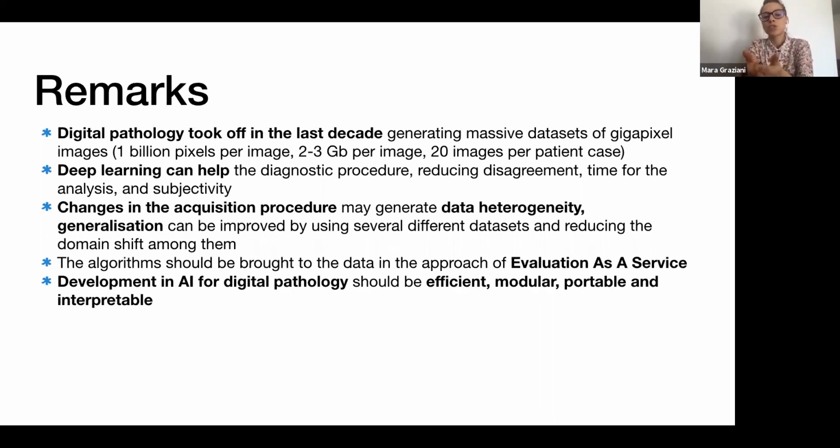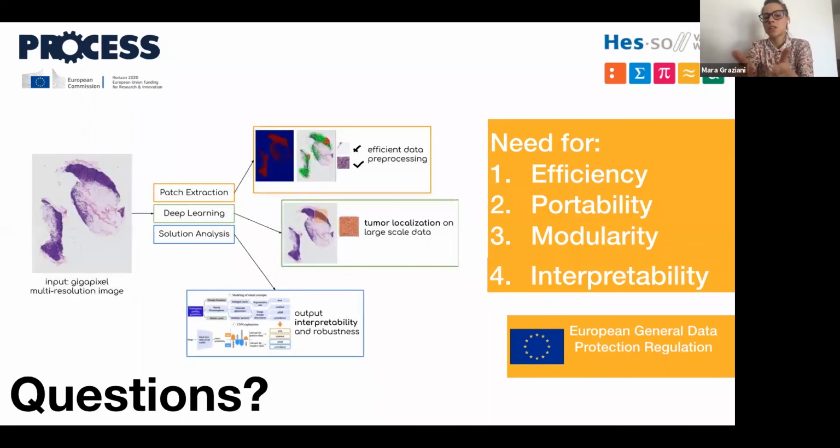The algorithm should be brought to the data in the approach of evaluation as a service. So everything we developed should be in Docker containers and should be possible for hospitals and private institutions to download them and train them. And development of AI for pathology should be efficient, modular, portable, and interpretable. And it is with this final image of our application and the needs that we try to address that I would like now to officially open the floor for questions, if there are any.